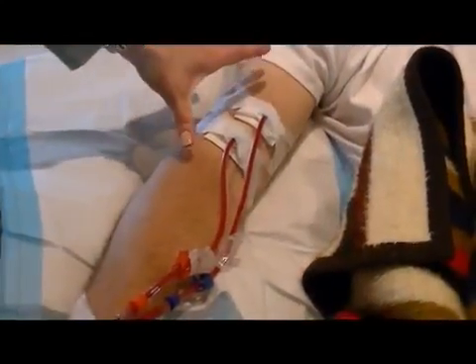His fistula is what we use here in his arm. He had a catheter in his chest beforehand, and they want to take those out as soon as possible because of the high risk for infection.